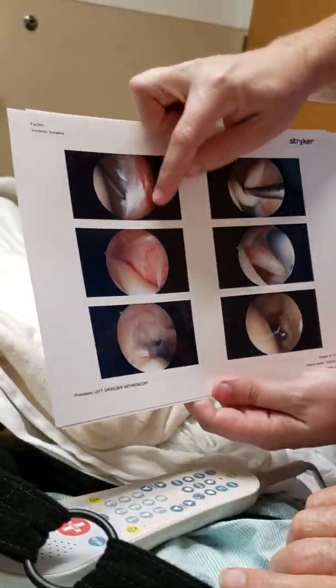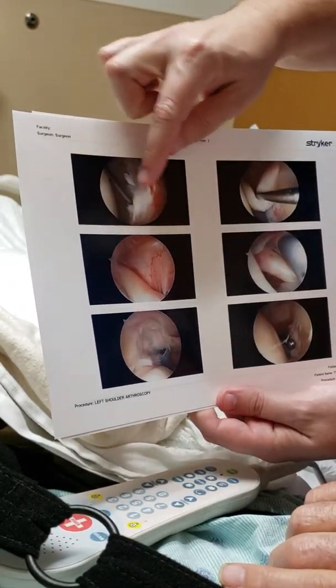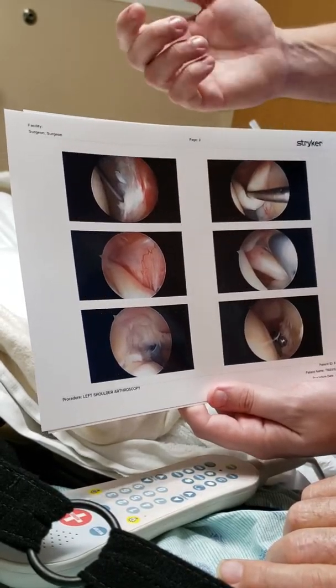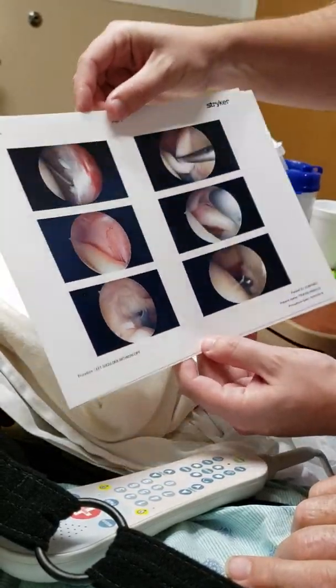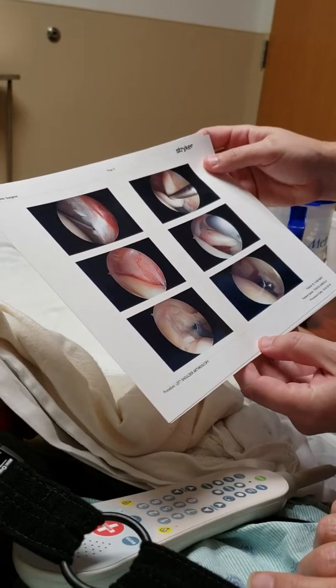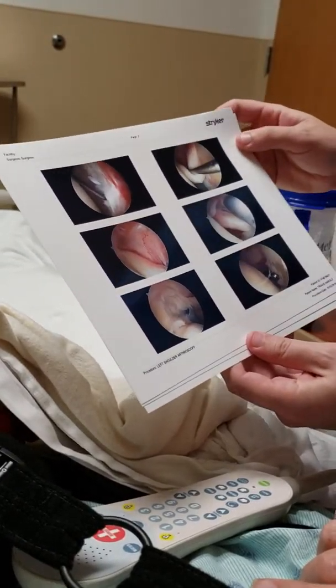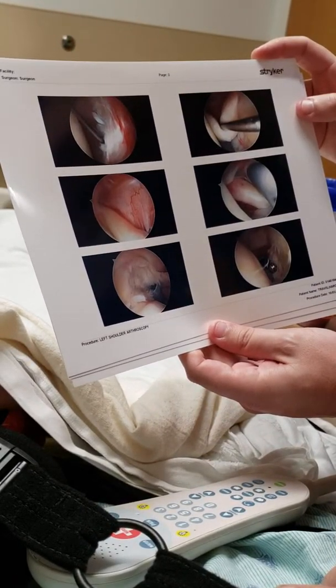Now we're looking at the back of your labrum. We were looking at the front labrum before; now we're looking at the back labrum — kind of the same thing. The tissue is a little frayed, it's red, so it's a little angry, but all things we kind of expect. That redness and inflammation should hopefully go away as your shoulder heals and the pain settles down.